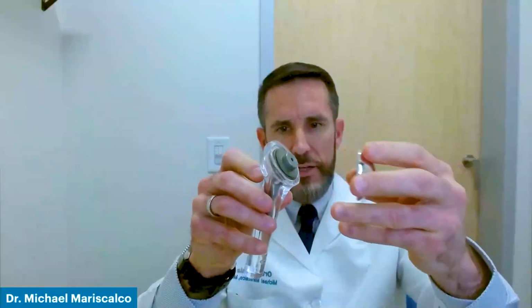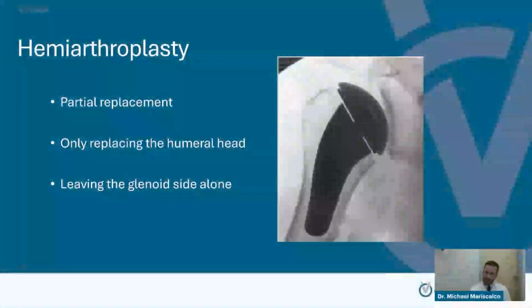And then the new head would sit over top, and it is mated with the actual stem, which typically has a piece that unites the two together. So that is a three-dimensional look with a sample that I brought in.